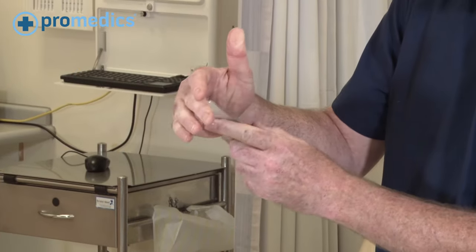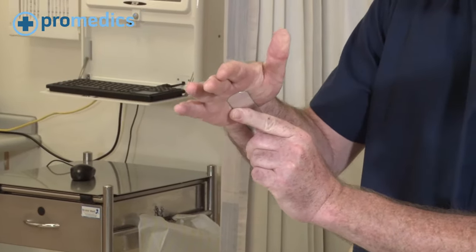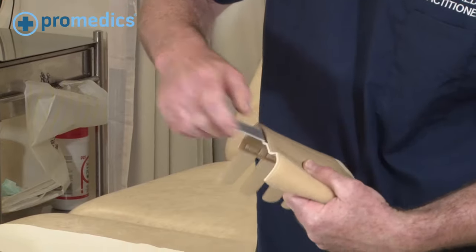You can adjust it to fit whichever position you require, then pop it back inside the centre of the brace.